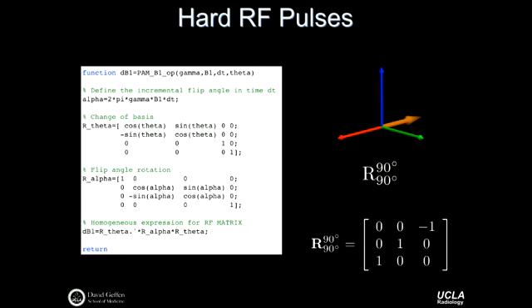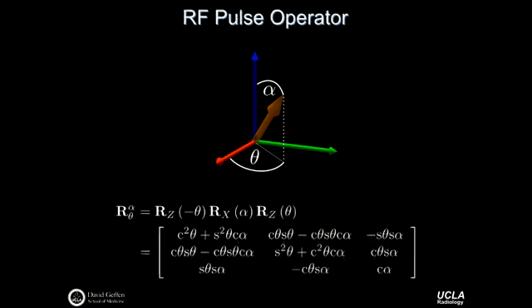Yes? So the slide where you abbreviate the cosine and sine as CNS, can we just use that matrix and plug it into MATLAB? Yes. And that's all this does. Rather than writing out that longer matrix form that has the sines and cosines and sine squareds and cosine squareds, this just uses that change of basis operation, exerts the appropriate flip angle, and then effectively rotates back so that it has the same effect of that operation. So this function ultimately just behaves like this.